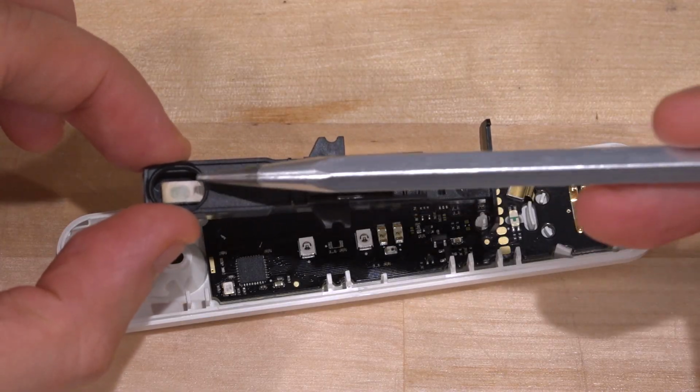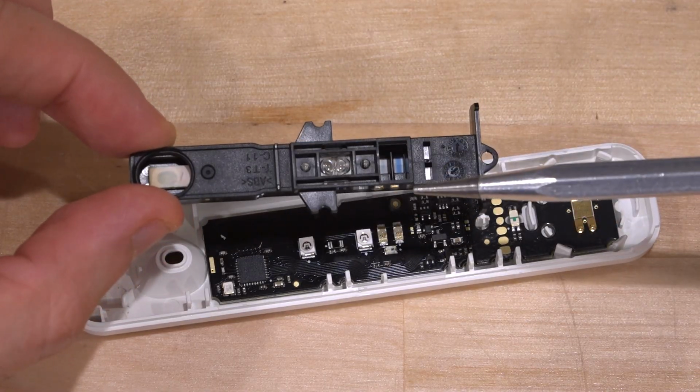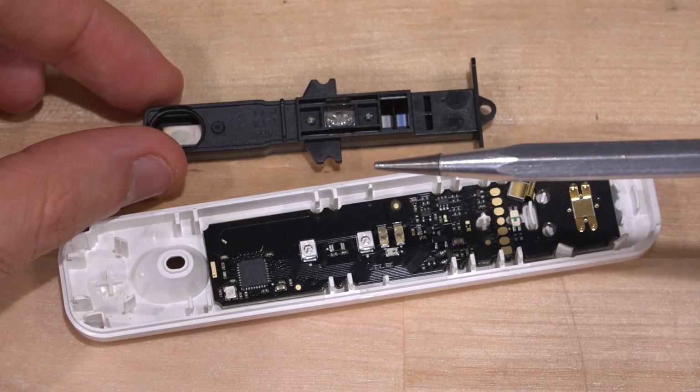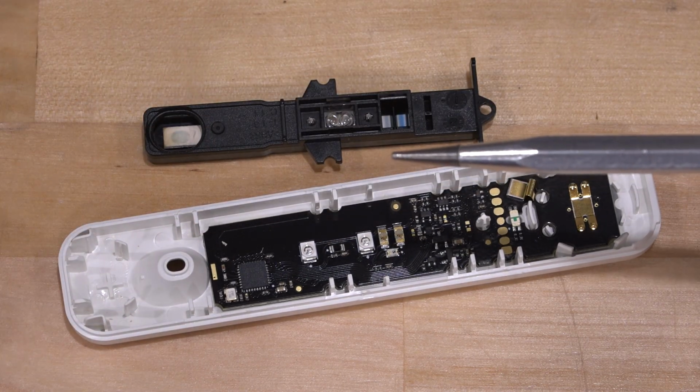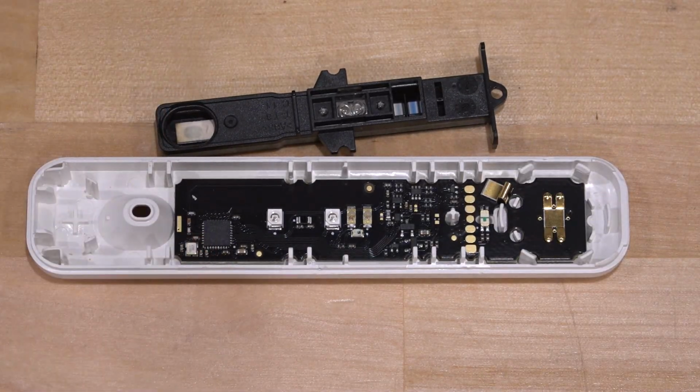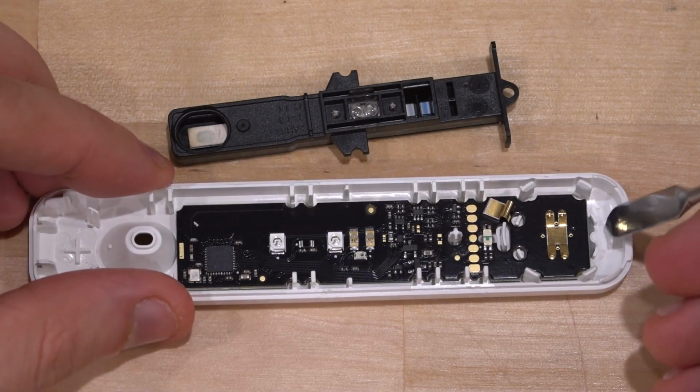This is used now, so you can see a bit of the line. This one was used a long time ago, so it's completely dry now. And sometimes the lines disappear when these things are left alone for a long time, even if they came back positive. They're only valid for like 15 minutes or so. So we should be able to remove this as well. And I bet we can power it on ourselves and see if any of those LEDs actually turn on.